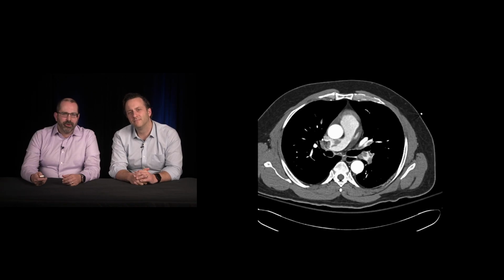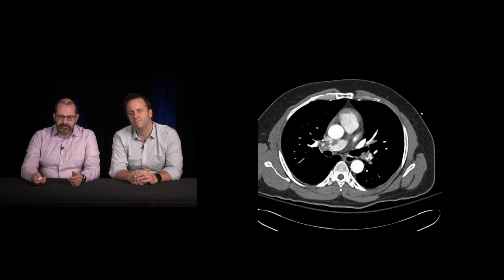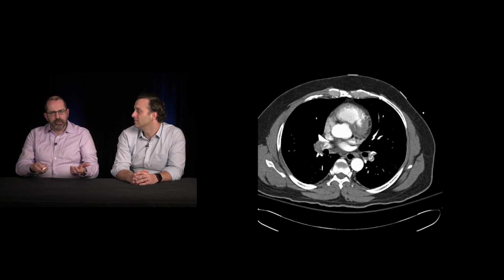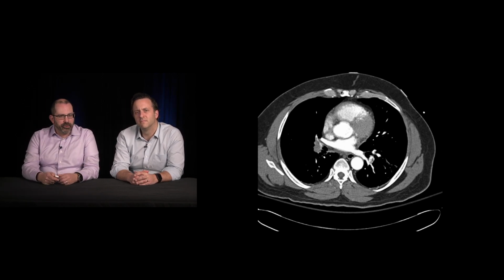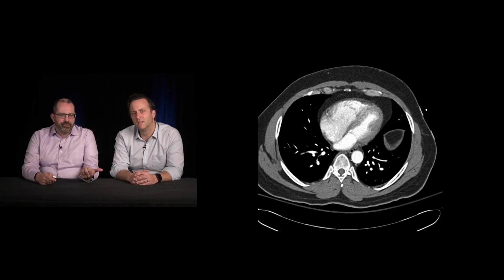And then they just keep going. They're everywhere. You can see them out here, you can see them up here, you can see them out here. So this is a massive PE. So we've identified the PE, then there's some other questions that we want to ask. And in particular, we want to look for things like right heart strain. And so as we continue down, anything else that sort of jumps out at you?